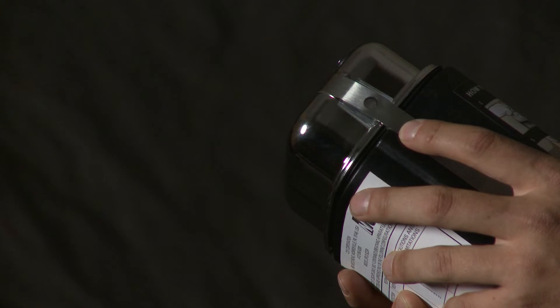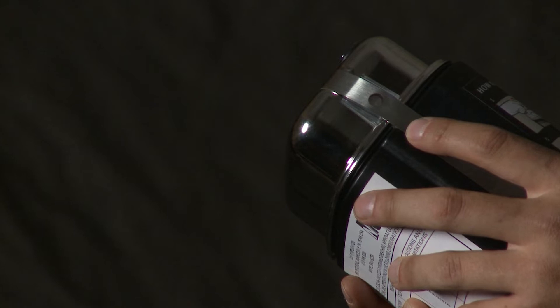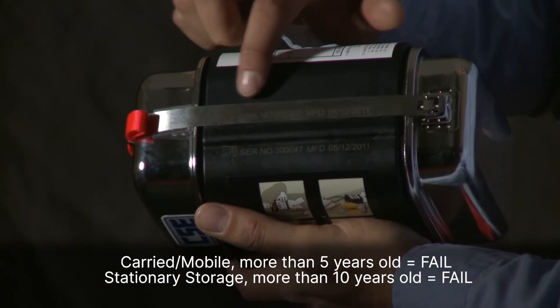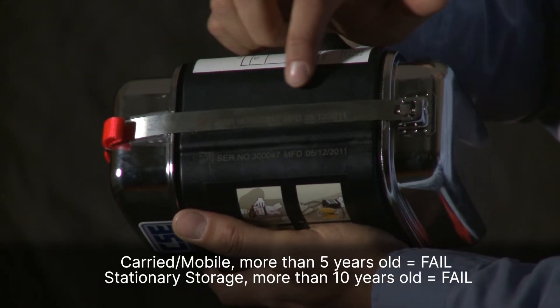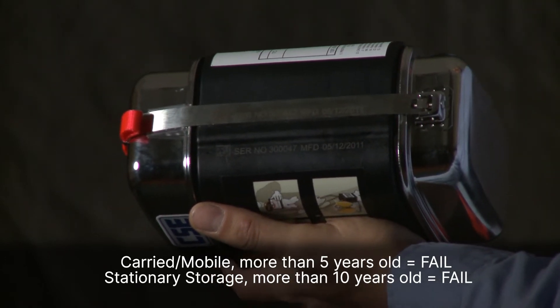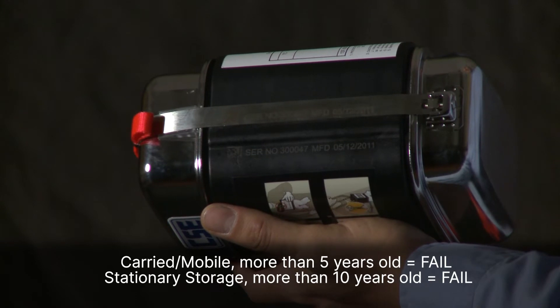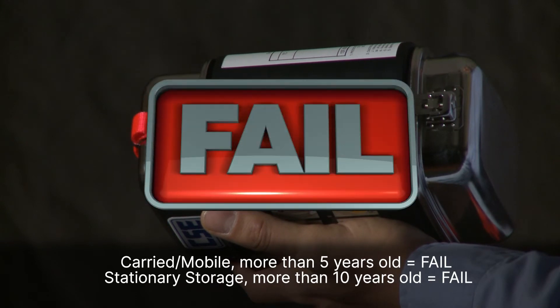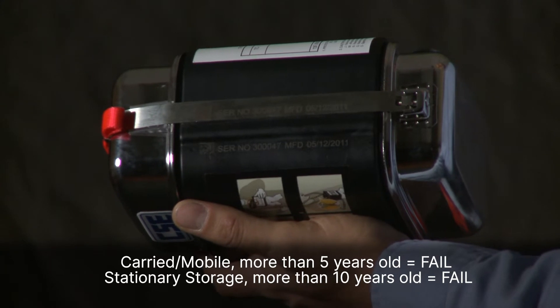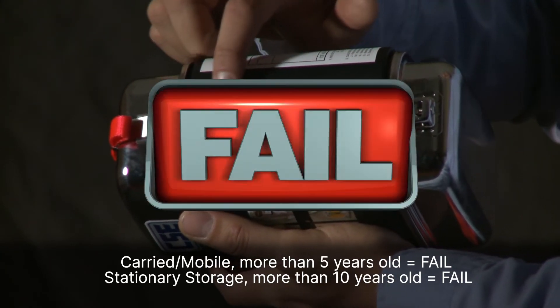The indicators are important because moisture and heat will damage the components and chemicals that produce oxygen when your SCSR is operating. Now check the date of manufacture. It's marked on the stainless steel security band and on the case next to the band. If it's been carried on the job and is more than five years old, take it out of service. If it's always been in permanent stationary storage and is more than 10 years old, take it out of service.